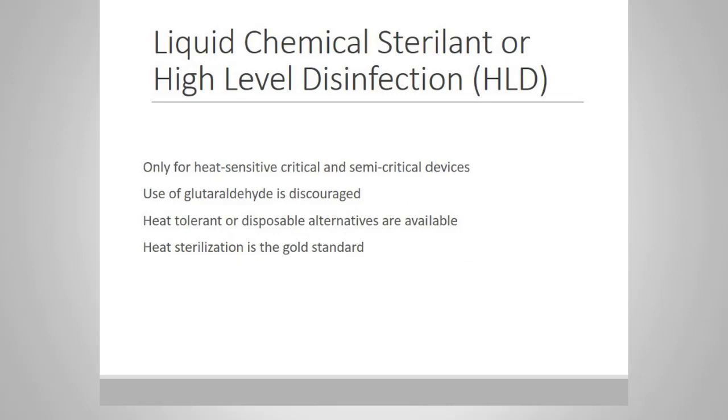Chemical sterilant or high-level disinfection should be used only for heat-sensitive critical and semi-critical devices, and the use of glutaraldehyde is discouraged. It's very, very toxic, and it makes debris adhere to the instruments more than other cleaning solutions. And there are many disposable alternatives that are available, and heat-tolerant alternatives that are available. So know that heat sterilization is indeed the gold standard.